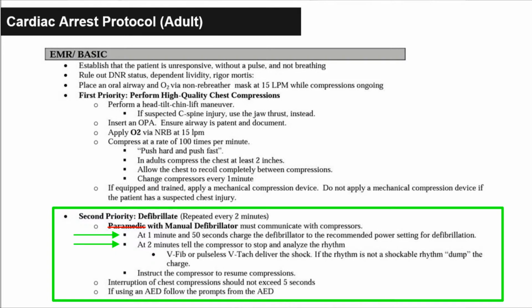It still says in the protocol that it's going to be paramedic with manual defib, but that's going to go down obviously to the BLS levels. It gives our timeline within here. So this is something, if you're sitting around your station, just keep reviewing that, especially because it's a new thing. We're going to be covering this over the next few months, so it won't be, like Matt said, you're not going to walk out today and start shocking people. But if you review that, you can kind of review your timeline. It does not have the dosaging, so we're going with AHA standards.